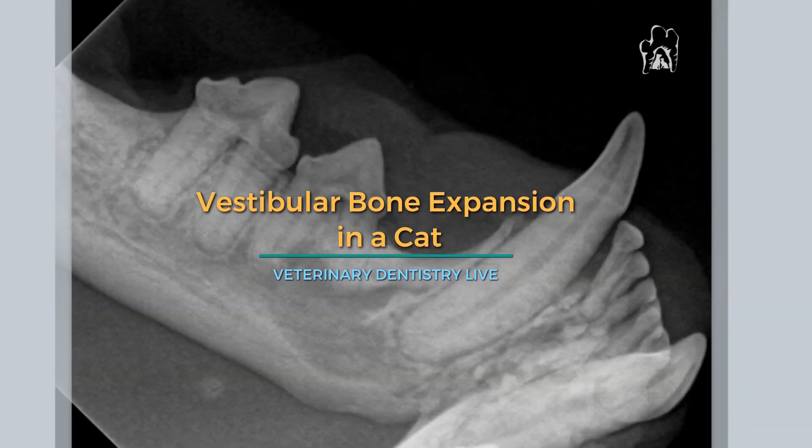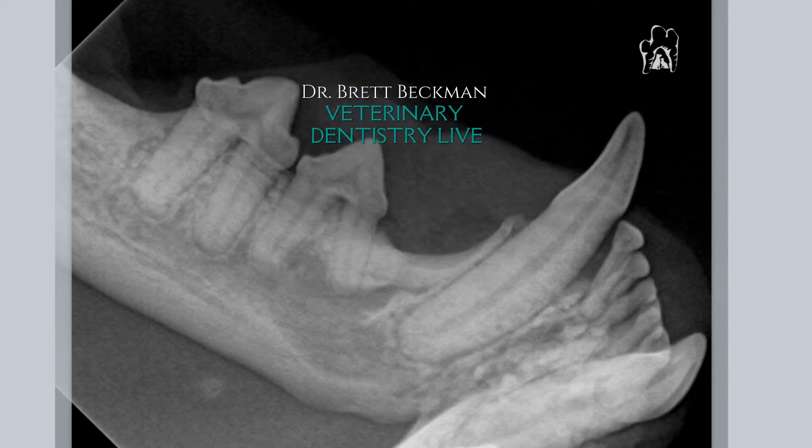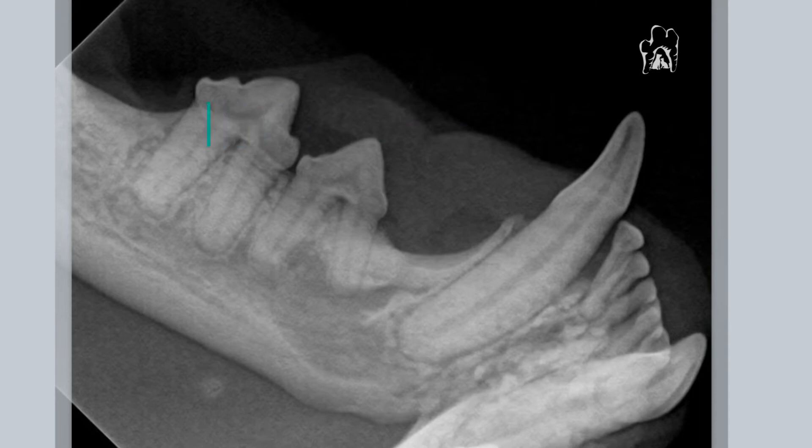This is a case of vestibular bone expansion in a cat — a fairly young cat, as you can see based on those pulp cavity diameters. If you look at the mesial aspect right at the marginal bone level, you'll see that there is a little expansion there. There's also bone loss adjacent to that incisor and a little bit on the canine as well.